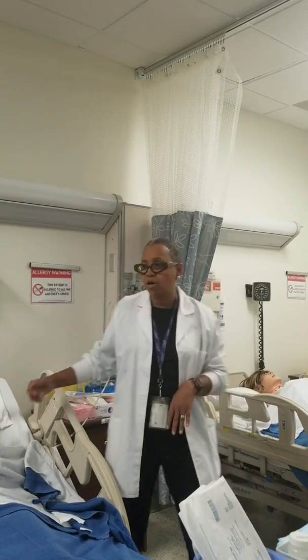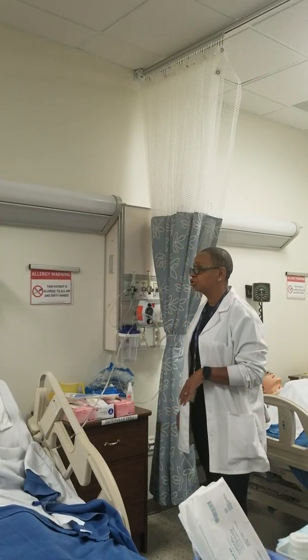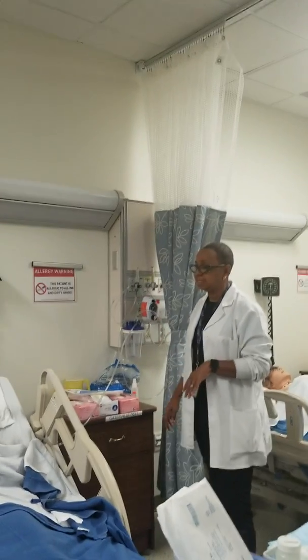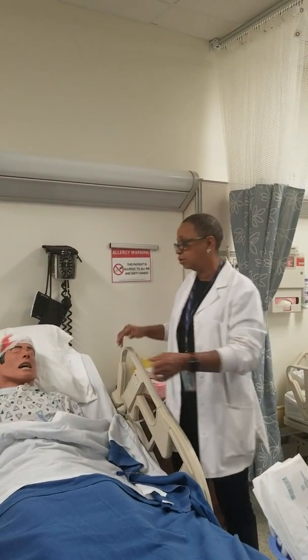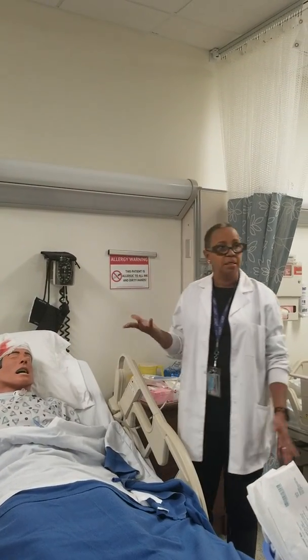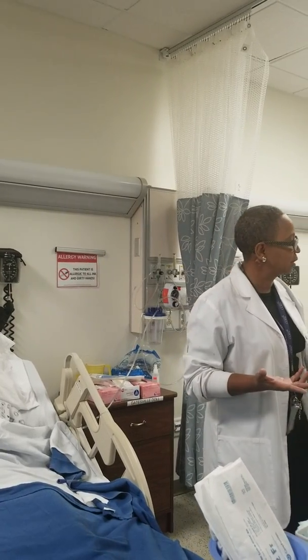If I walk in here and he's on a ventilator or he's on a trach collar and it's at 50%, then I may need somebody in there, because if he's not able to help, like this lovely lady here, then I might need somebody in there to help me maneuver this, okay? Does that make sense? Okay?